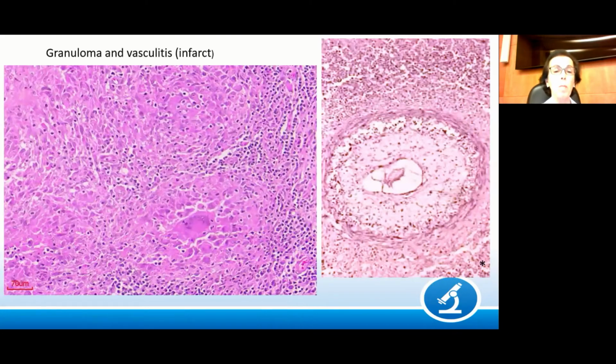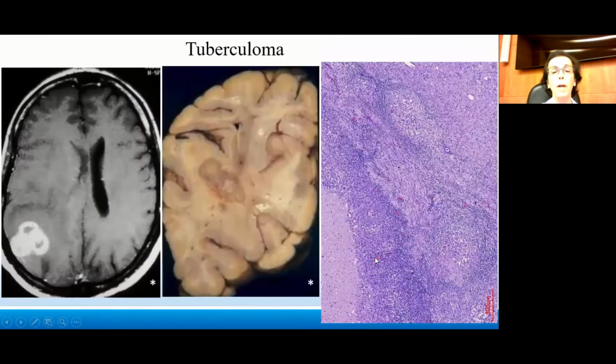Histologically, there are granulomas here. There are lots of epithelioid cells. Here is a giant cell, a Langhans giant cell. There are mononuclear cells, and here a vasculitis. This was taken from an old slide, so the focus is not very good, but the lumen is almost closed. Sometimes we see the giant cells, the granuloma, in the walls. So these are responsible for infarcts.